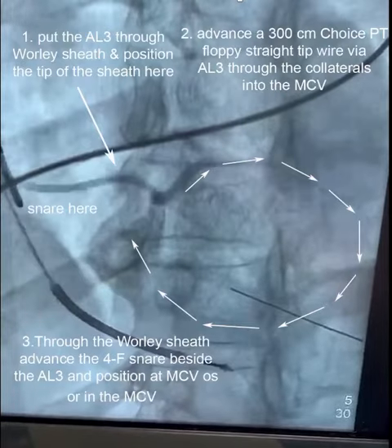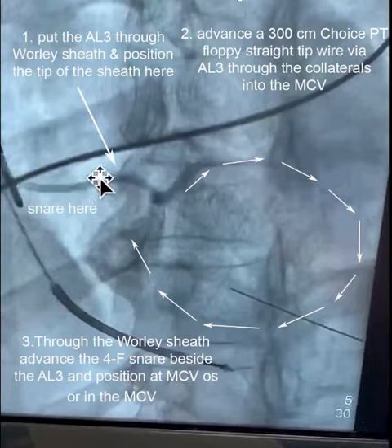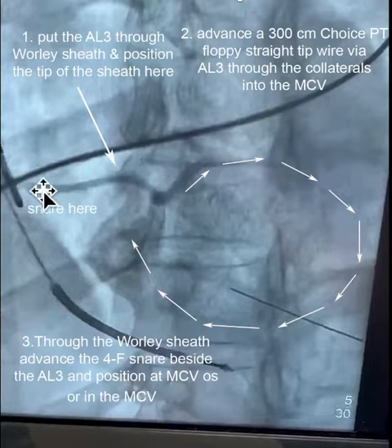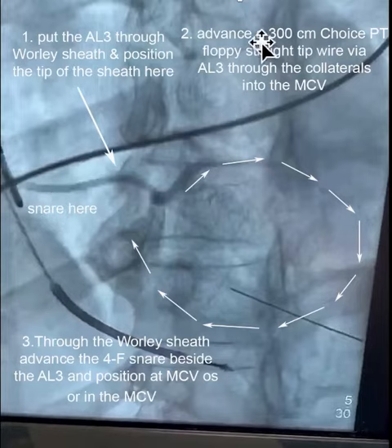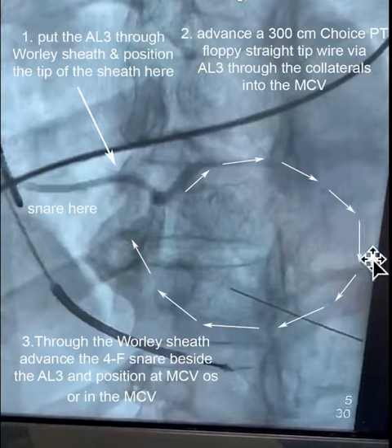So how would you implant such a case? First, you would put the AL-3 that engaged this branch through the Worley sheath, which is a nine French internal diameter. Number two, you advance a 300 centimeter Choice PT floppy wire straight tip through the AL-3, around the collaterals, and then back into the middle cardiac vein.